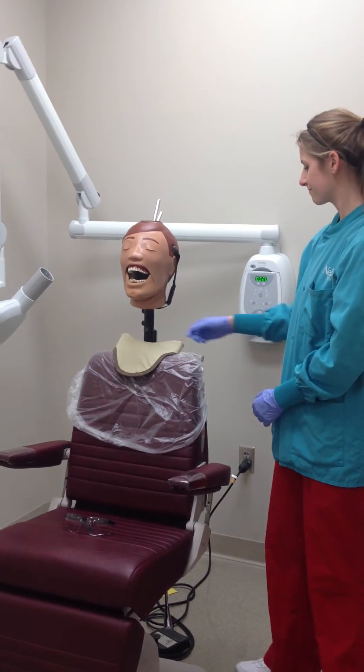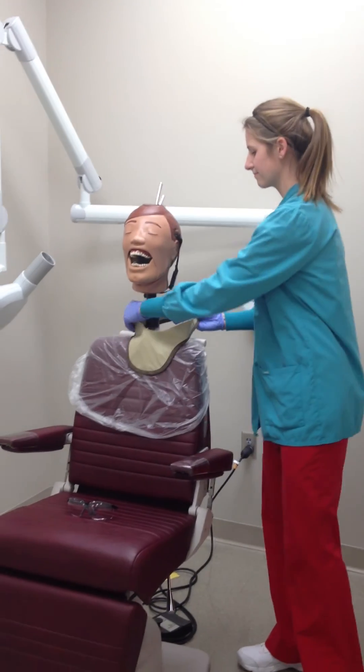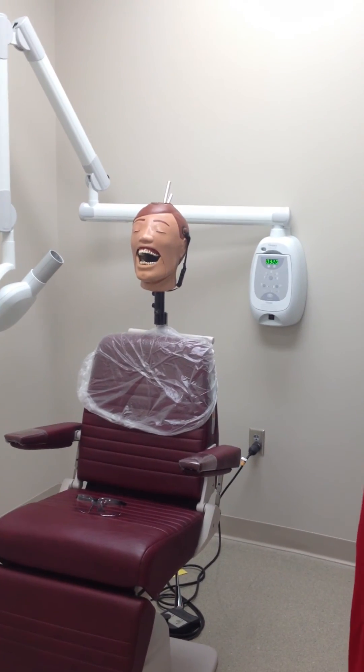After processing the image from the receptor, return to the patient, and if no retakes are necessary, remove the thyroid collar and dismiss the patient back to the waiting area so you can clean up the unit.